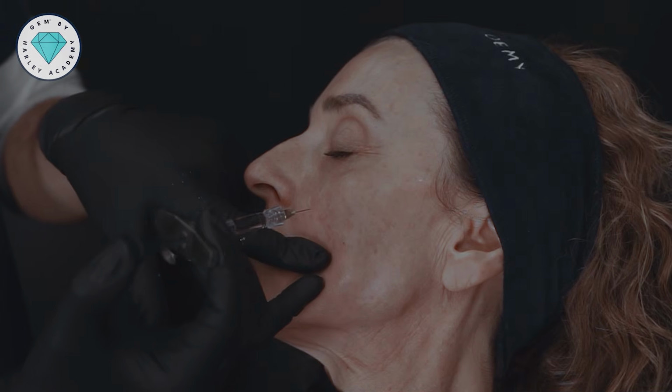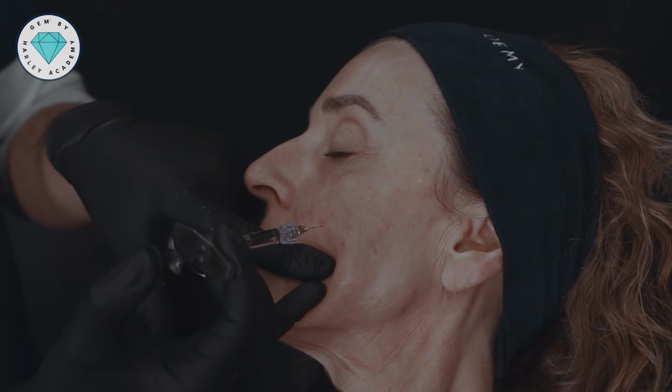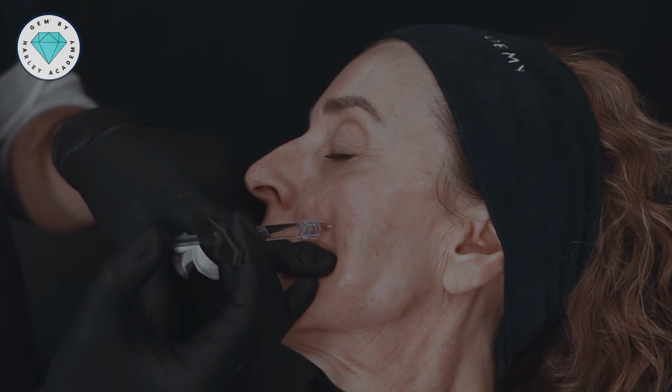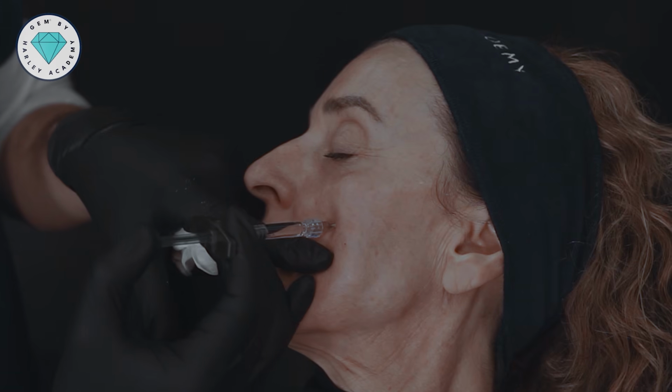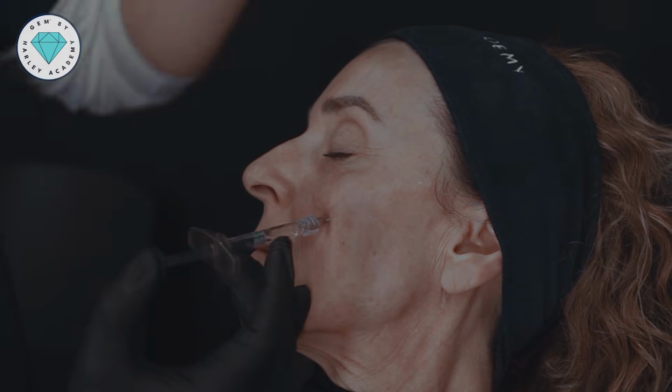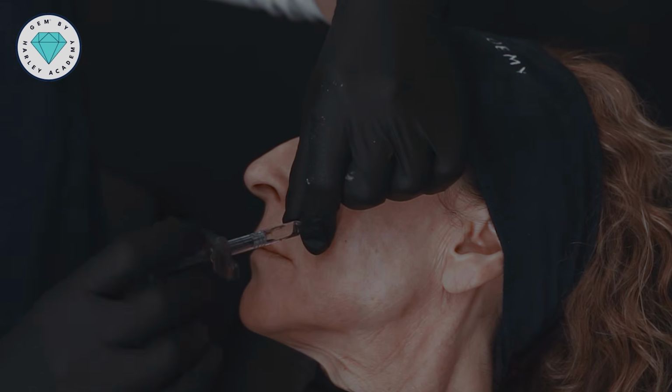What divides the deep medial and the deep lateral is the levator anguli oris muscle. There. So down onto bone. We aspirate again.